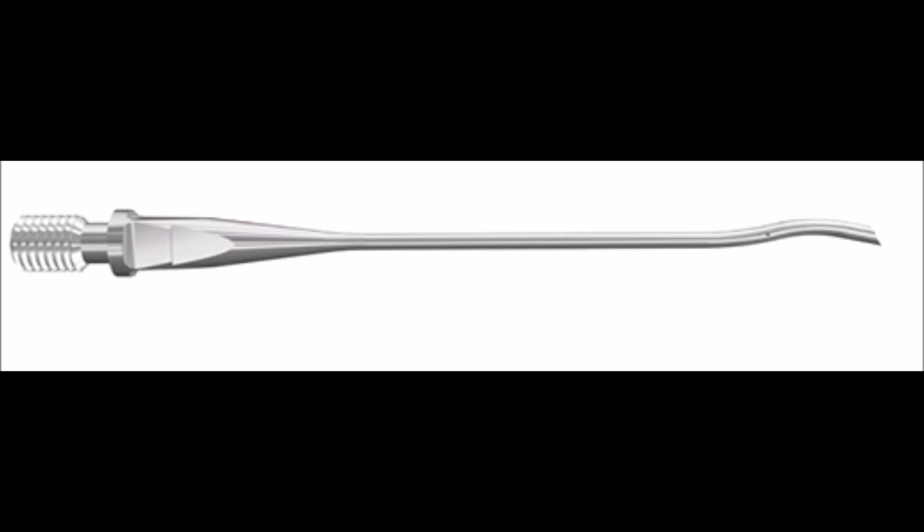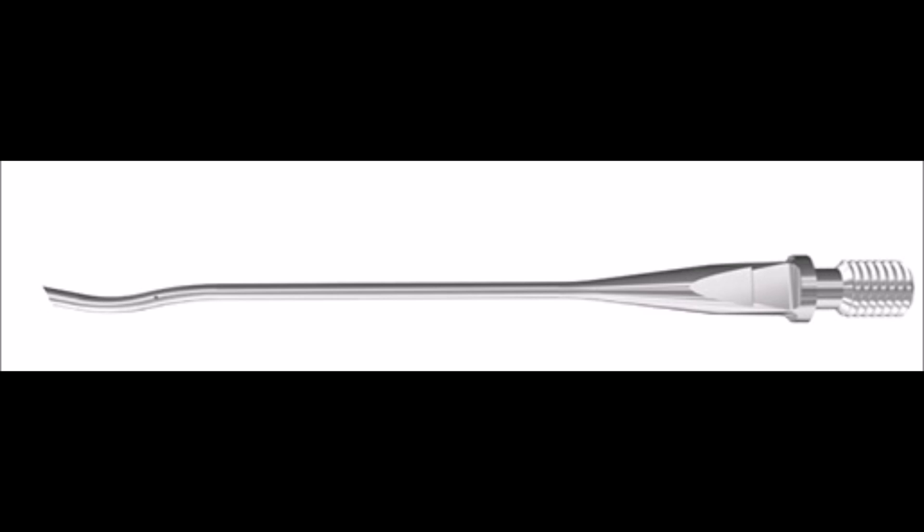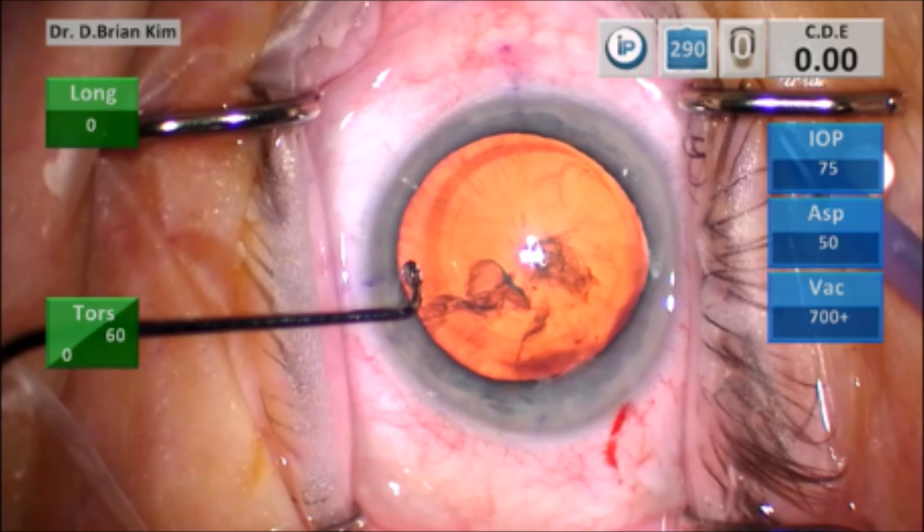This is the Alcon balance tip. I flip it 180 degrees so that it's beveled down, and you can see when it's beveled down there's actually a little bit of a curvature to the phaco tip. I use that curvature as the part that actually touches the lens as I fracture it, pushing it forward.